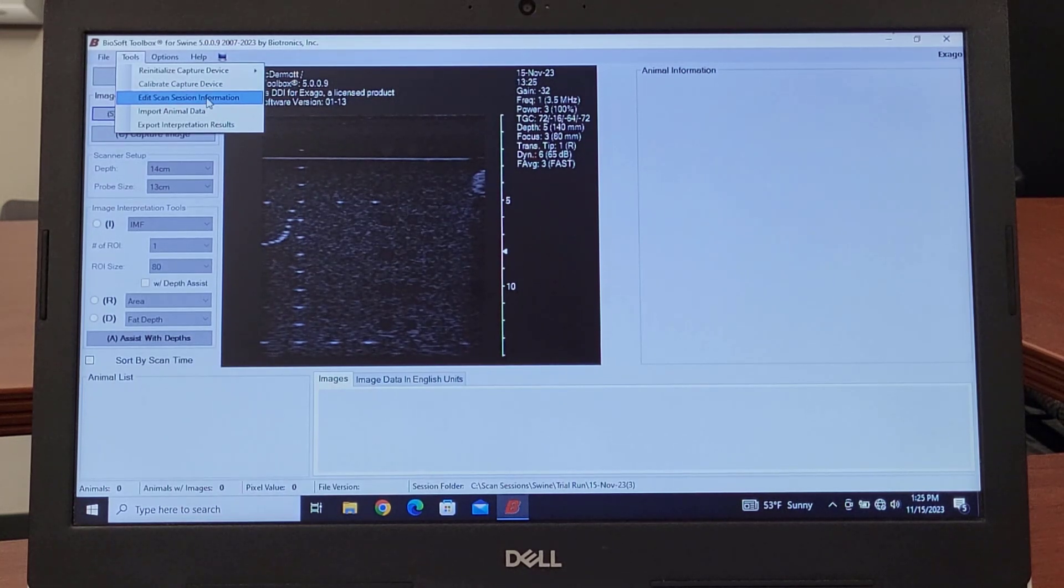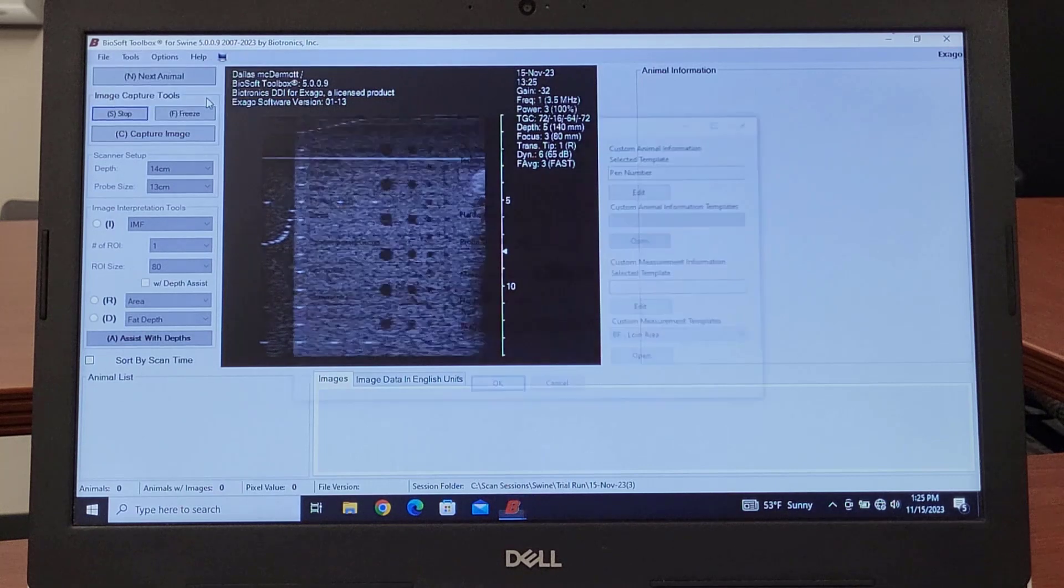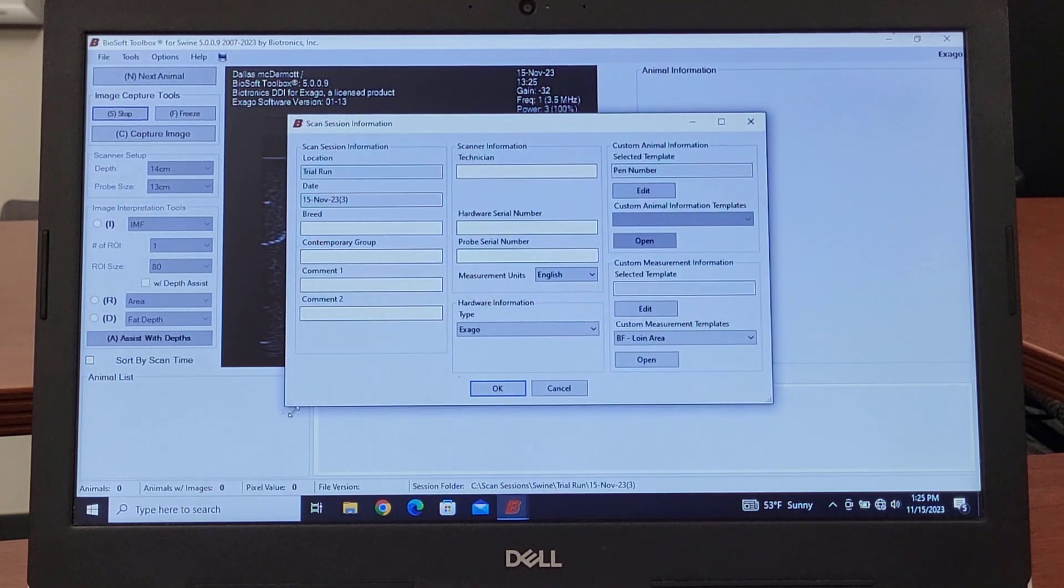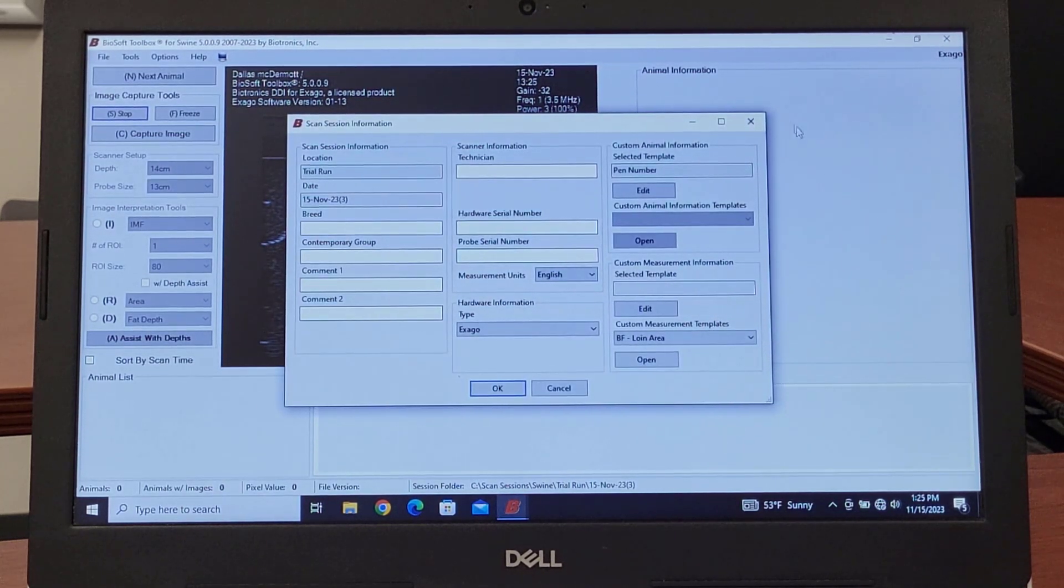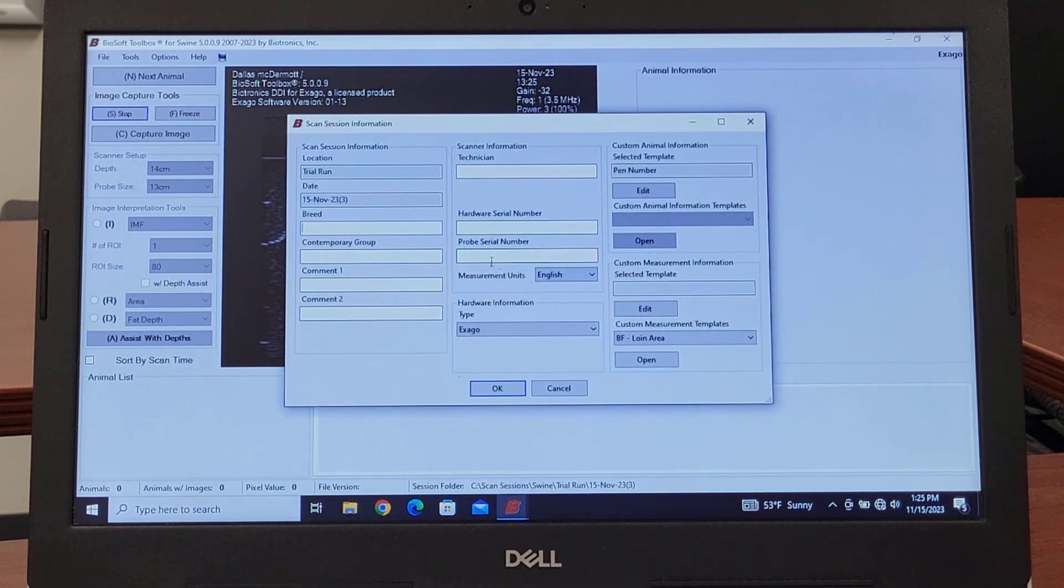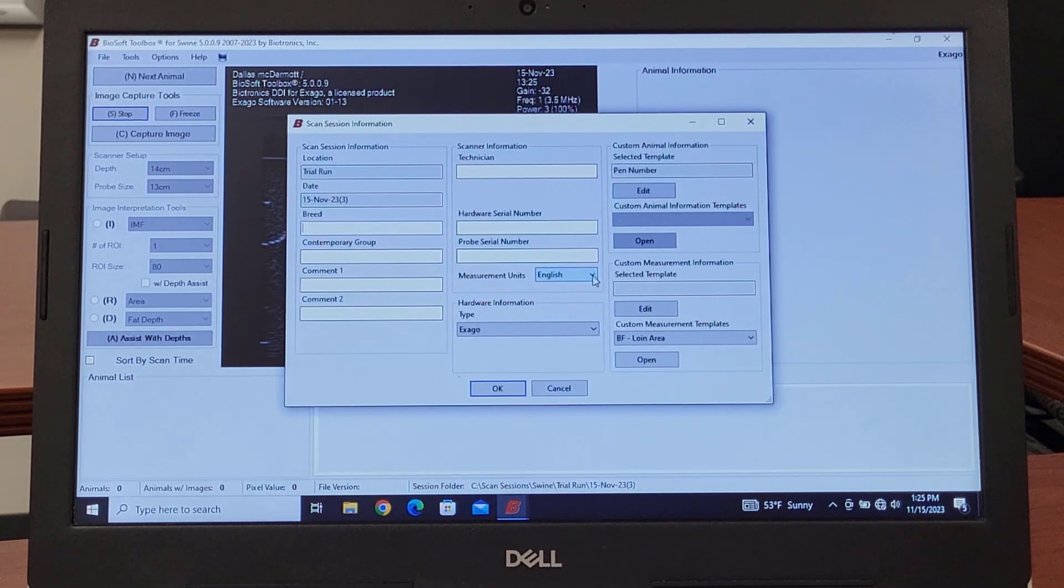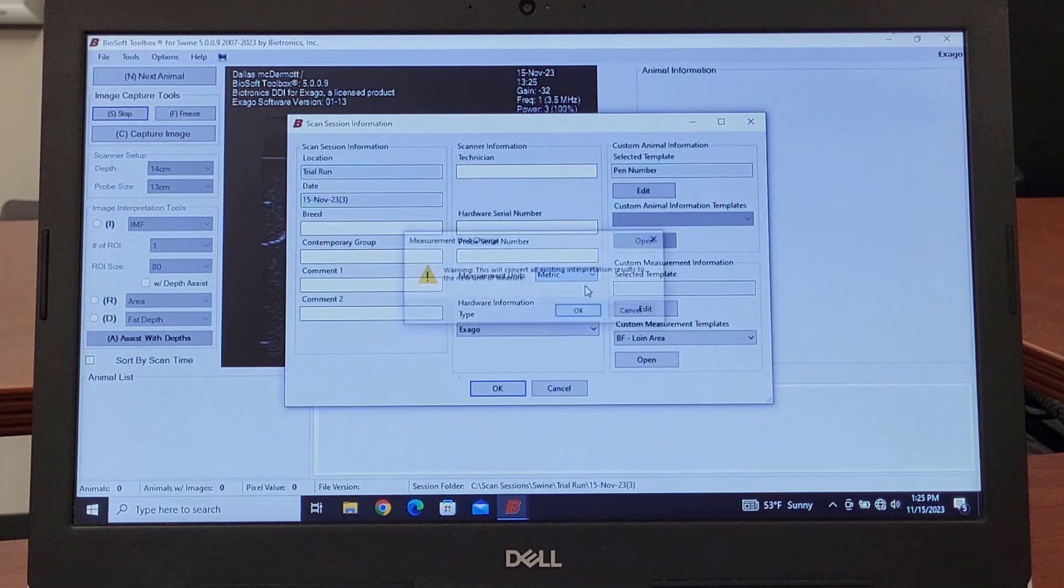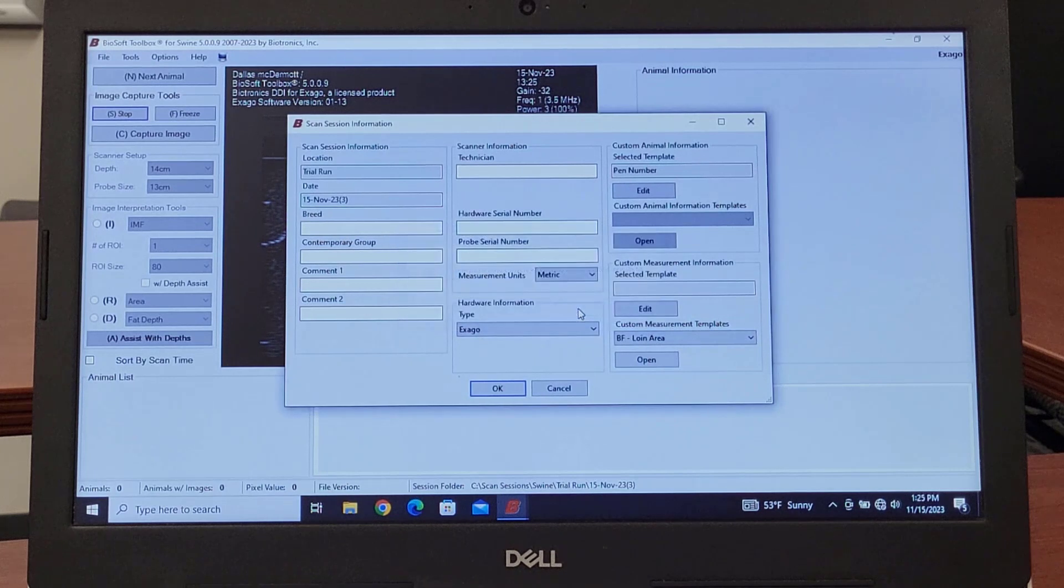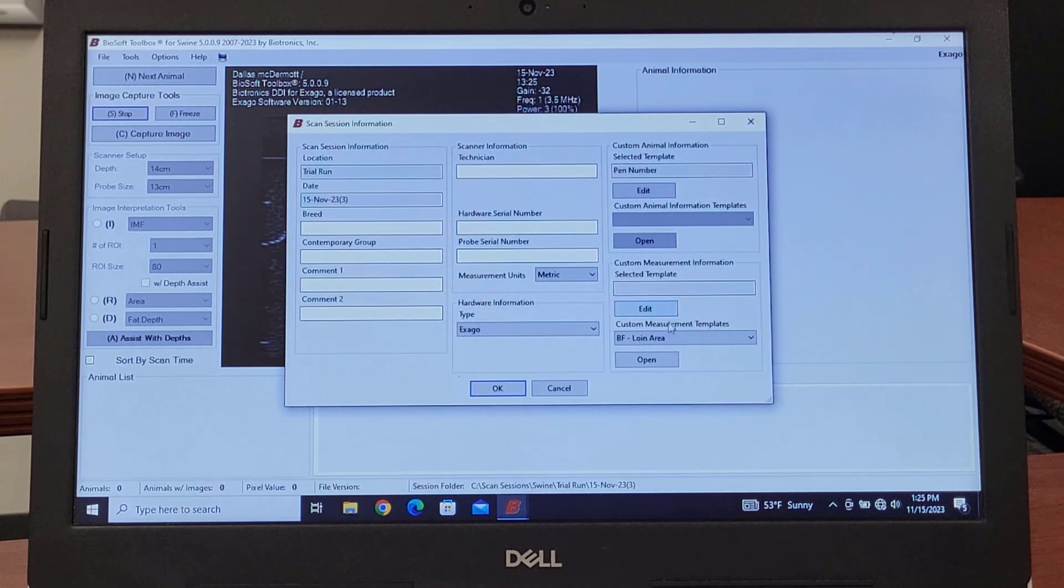So if you get into something that you need to go back and edit something that was put into the original scan session, when you click on that we're going to get a field pop-up that looks like the new scan session. If you need to make any changes anywhere, if you want to change from English to metric or anything like that, we can do that there.